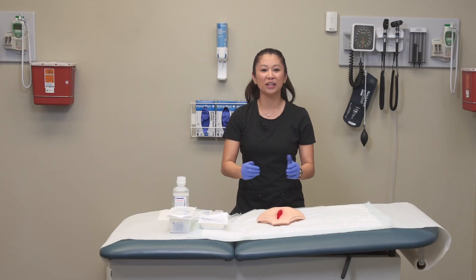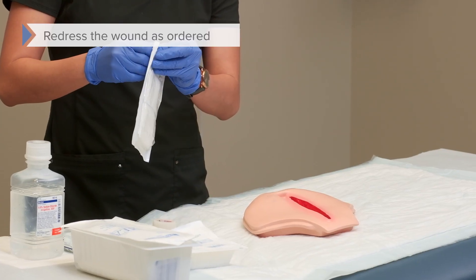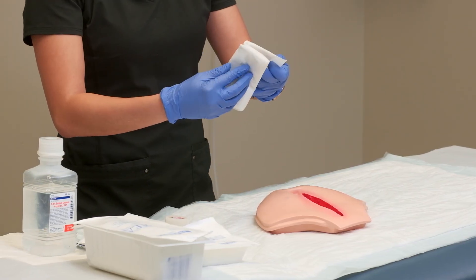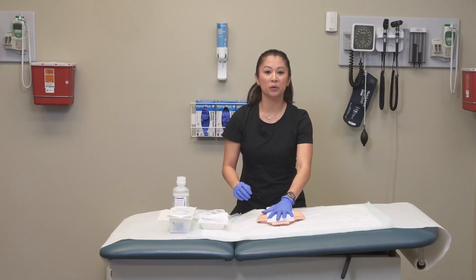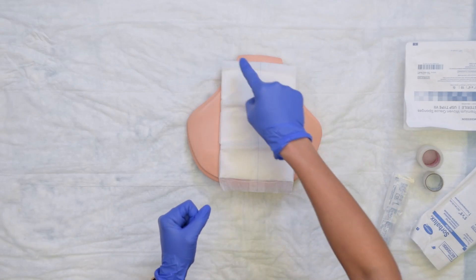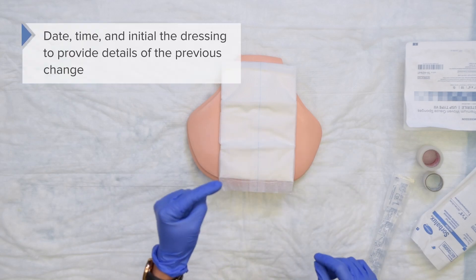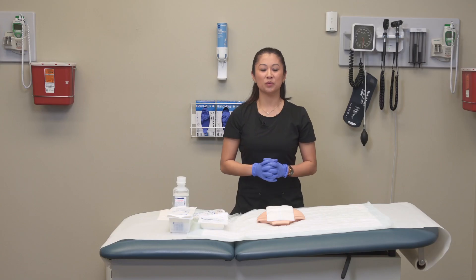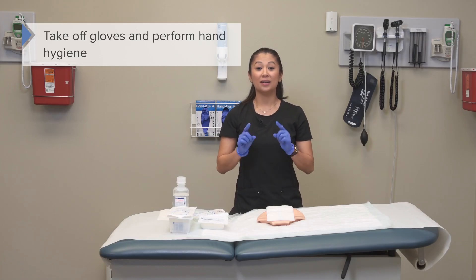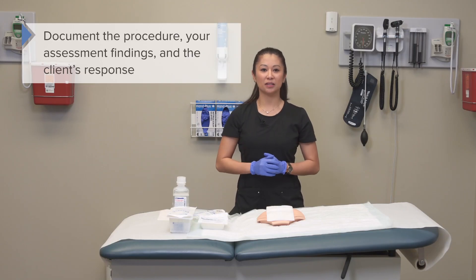Don't leave the wound open — redress it as ordered. Using sterile gauze or an ABD pad, cover the wound. A useful technique is the window tape method, taping around each corner. Put your initials, date, and time on the dressing so the next shift knows when it was changed. Remove gloves, perform hand hygiene, and document the procedure, your assessment findings, and the patient's response.